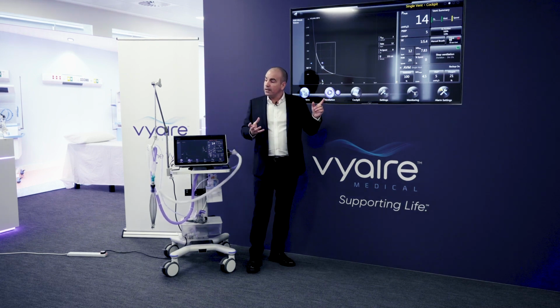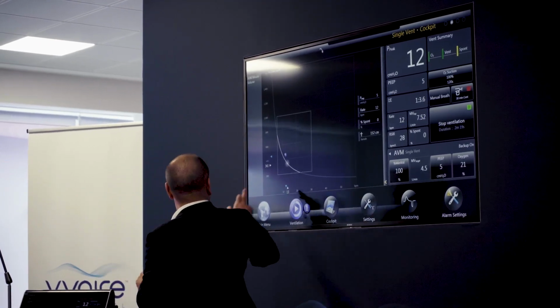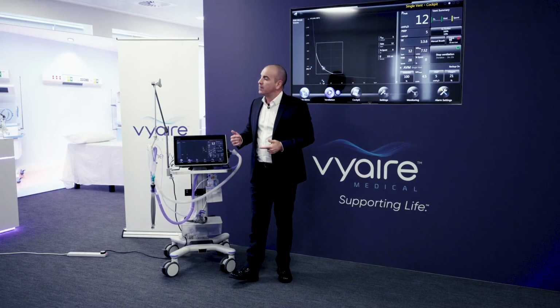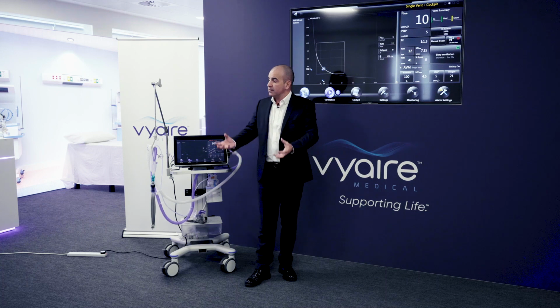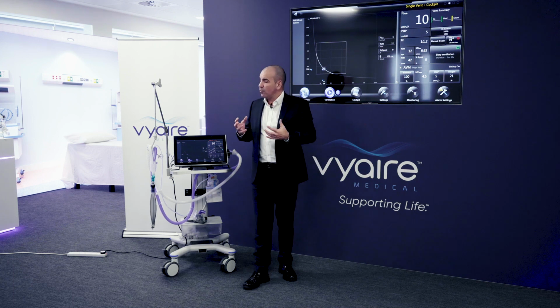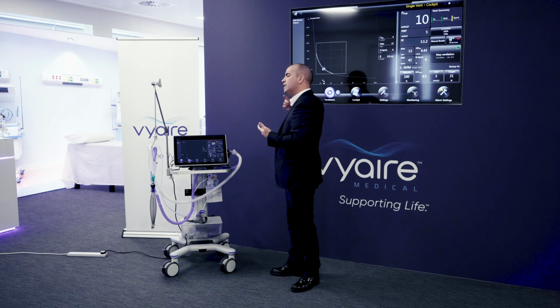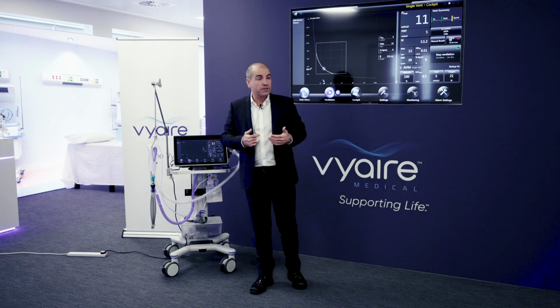What AVM is doing, you see this little white dot here? It's almost like a biofeedback system. It's taking the lung mechanic data back into the system and processing that, and always aiming for the lowest work of breathing for the patient. So it's seeing how tight the lungs are, how tight the airways are, taking that into account to make it as easy as possible and as comfortable as possible for the patient.